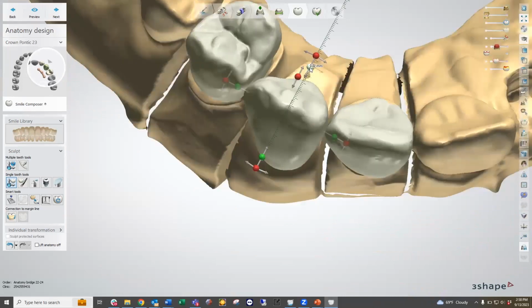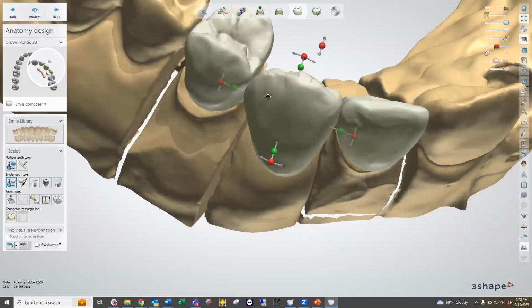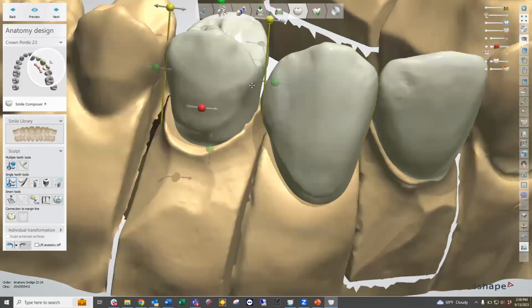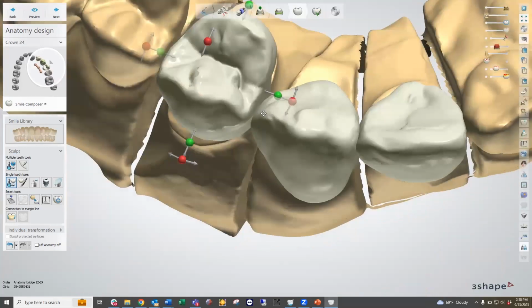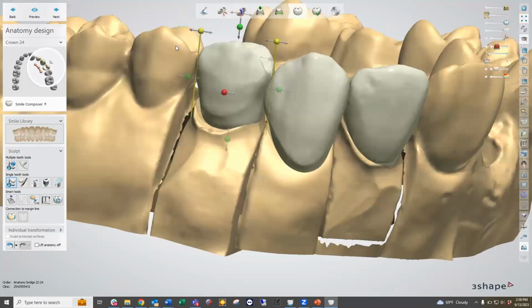So the biggest difference between single tooth crown design and bridge design is that we have to pay attention that we're not designing one tooth at a time, we're designing the 3 teeth at the same time. Typically, that involves making sure that the necessary contacts between those teeth aren't overdeveloped. We don't want them to look unnatural, and the contacts we'll be paying attention to on our models are relative to our neighboring teeth. So we just make that change as necessary.